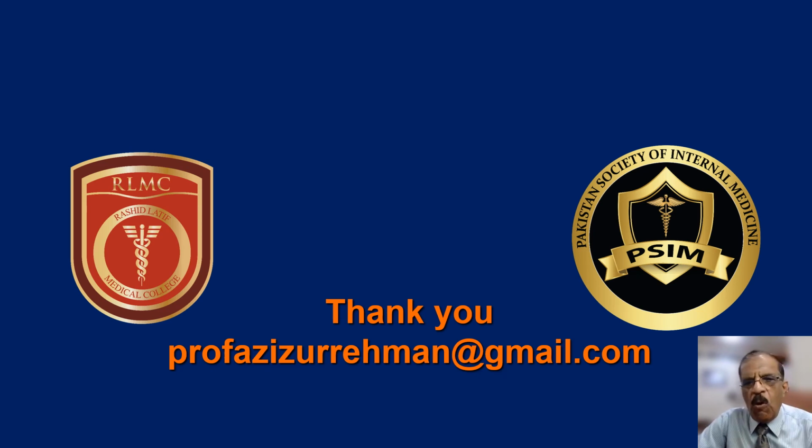So that was it. I hope this module was useful and you have learned how to make an ECG diagnosis of left ventricular hypertrophy and right ventricular hypertrophy. I told you at the outset these criteria are not very sensitive. If you're really interested to know if somebody has left or right ventricular hypertrophy, you should opt for echo. But when you're diagnosing by ECG, you must never miss right or left ventricular hypertrophy, because if ECG criteria are met, most probably the condition is already fairly advanced and you don't want to waste any further time. So I think that is the lesson.